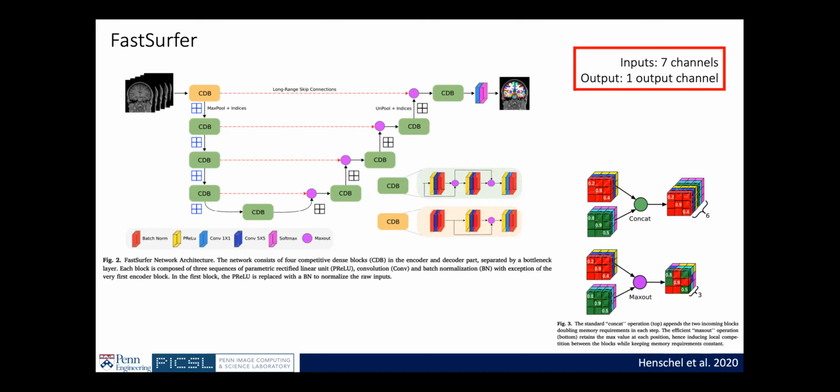Right, so what I showed you here is for the coronal slice. Again, this looks like a U-Net, right? You have this U-shaped structure, you have these skip connections. But there are 2 things that they do differently. The first thing is that in U-Net, if you remember, you have output from this particular layer, and you have output from this particular layer. In U-Net, they just concatenate the 2 features, right?